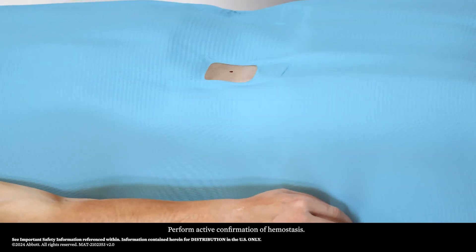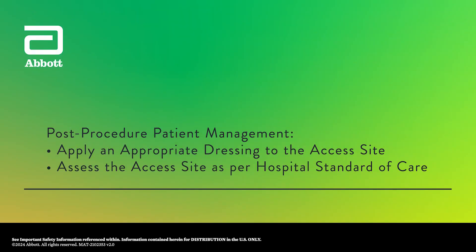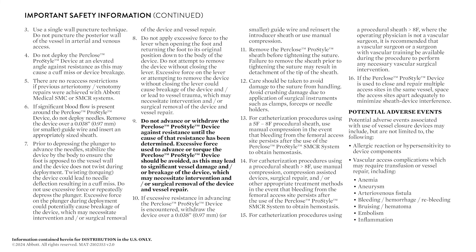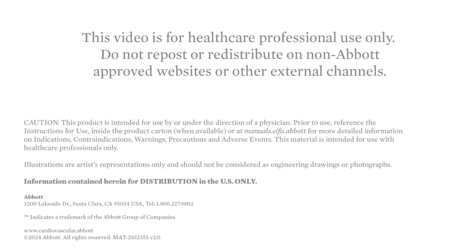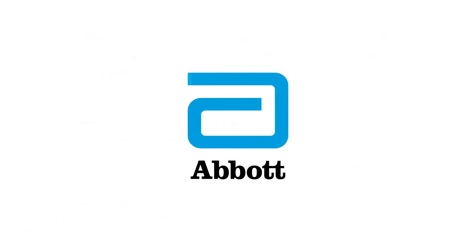Perform active confirmation of hemostasis. Apply an appropriate dressing to the access site. Assess the access site as per hospital standard of care.